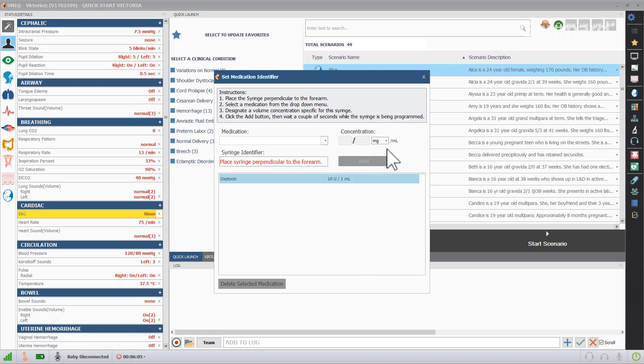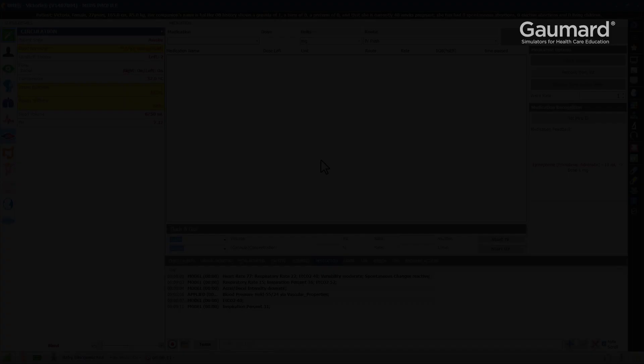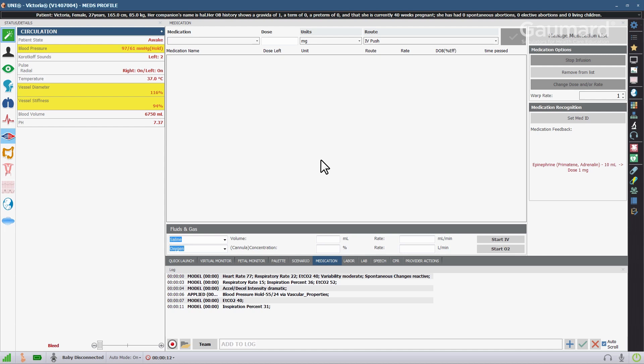Repeat the process to program as many tagged syringes with as many different medicines or concentrations as necessary for the exercise.